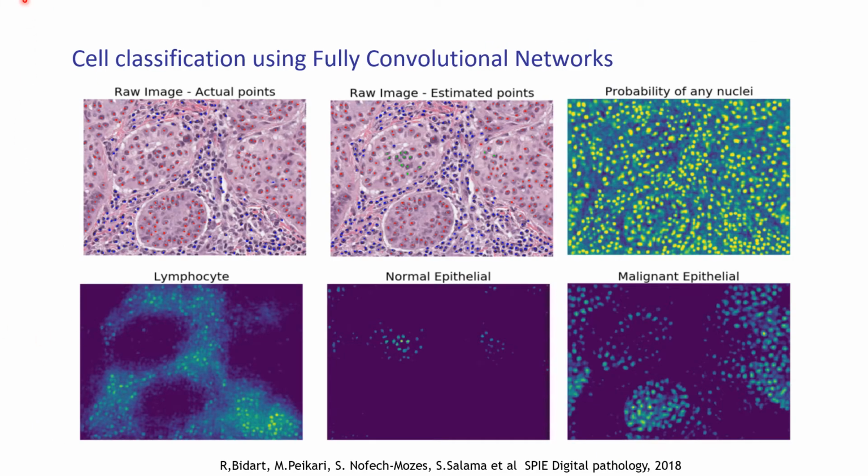So just one year later, I finally converted the lab onto deep learning methods. So this is a student who took the same data and simply used a fully convolutional network. So here the network was simple. He just took a 32 by 32 patch and then moved it across the image, I think a few pixels at a time. And then for each position of the patch, he trained a classifier to say, is there a nucleus in this patch or not?